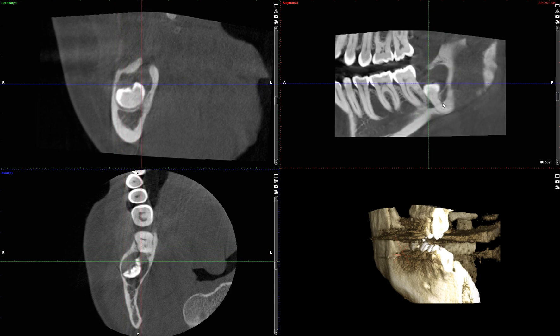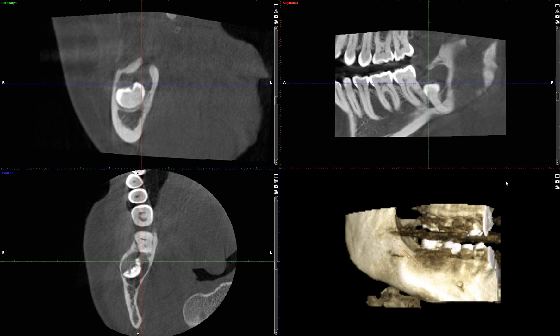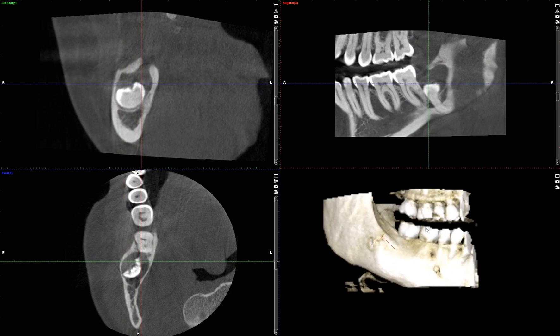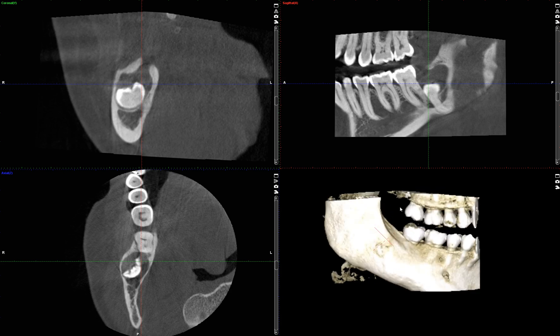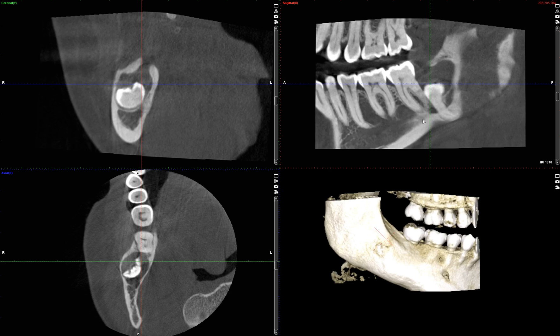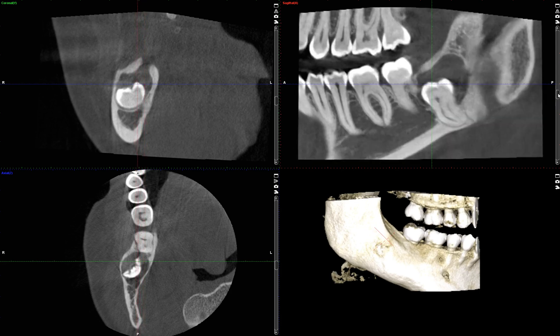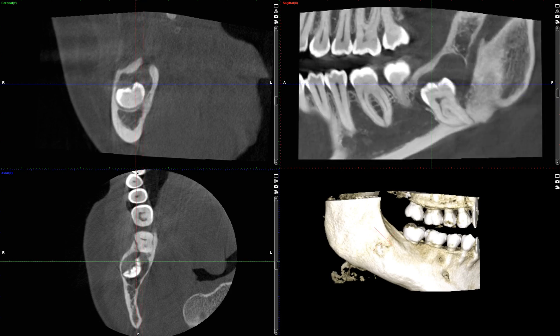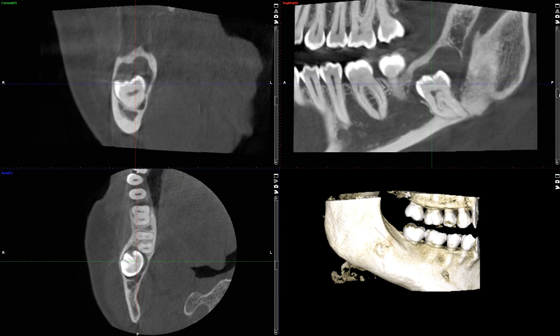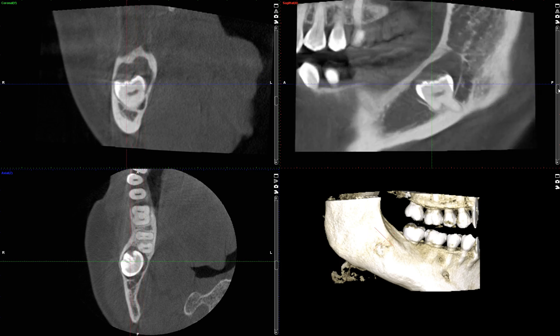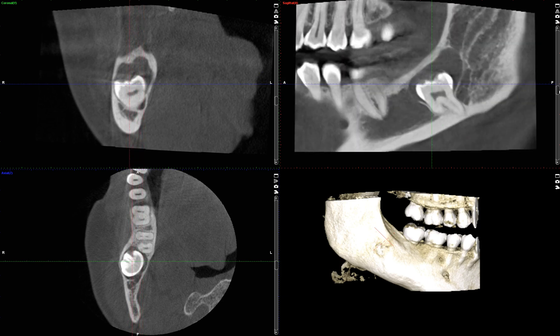So the question is: what is this? For those of you in D3 and D4, you should be able to start coming up with your own differential diagnosis. I don't know definitively either, because this has not been biopsied yet. But based on the radiographic appearance, I have a pretty good idea. The biggest clue I can give you is that this lesion appears attached right at the level of the CEJ — do you guys see that? Right at the level of the CEJ, and that is a big, big clue for us.